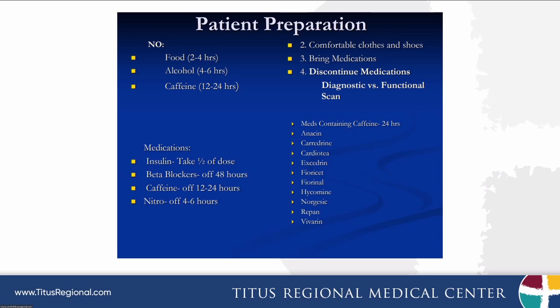Again, in these studies, patient preparation is extremely important. These patients should be fasting. They should avoid caffeine because that can interfere with binding of agents to the myocardium. They should avoid other caffeine-containing medications. They should avoid nitrates. If you're doing a stress test on the patient on a treadmill and getting nuclear imaging, then again, you want to avoid beta blockers or the non-dihydropyridine calcium channel blockers so that we can get them up to an adequate heart rate. And of course, in this, as in all tests, you have to have good IV access for the patient so that we're able to inject them with the agents we need in order to image them.